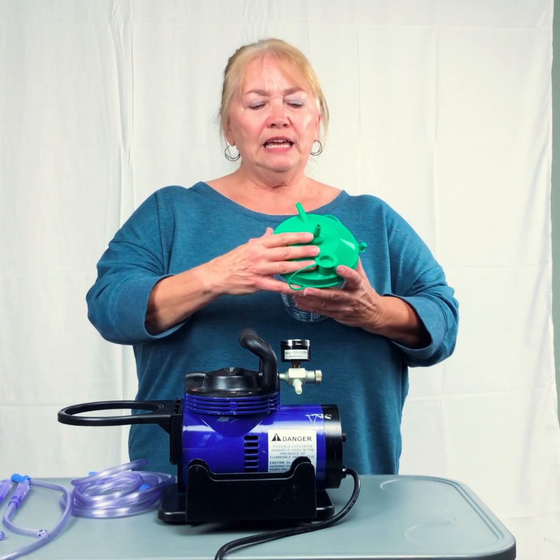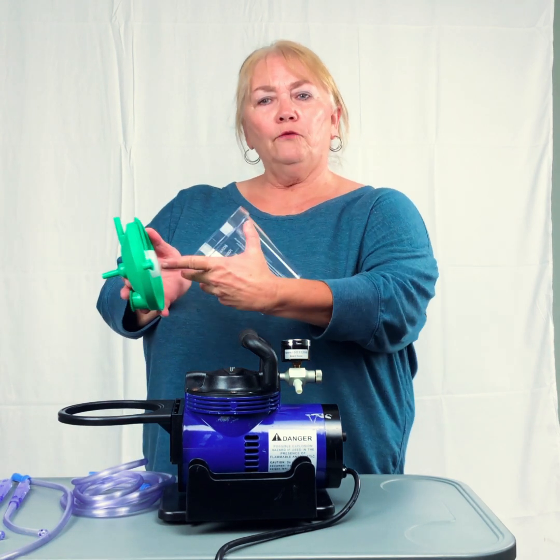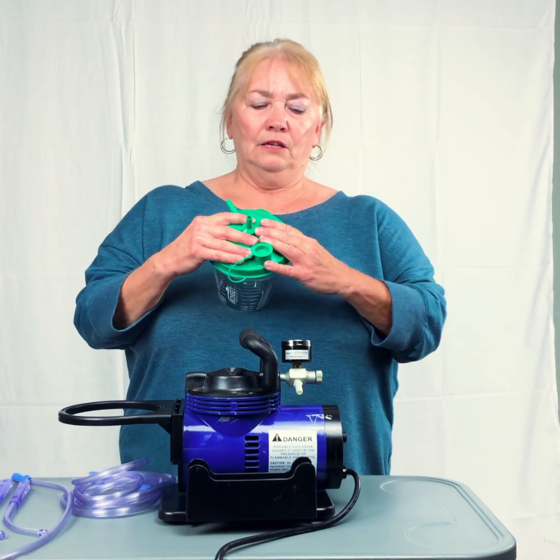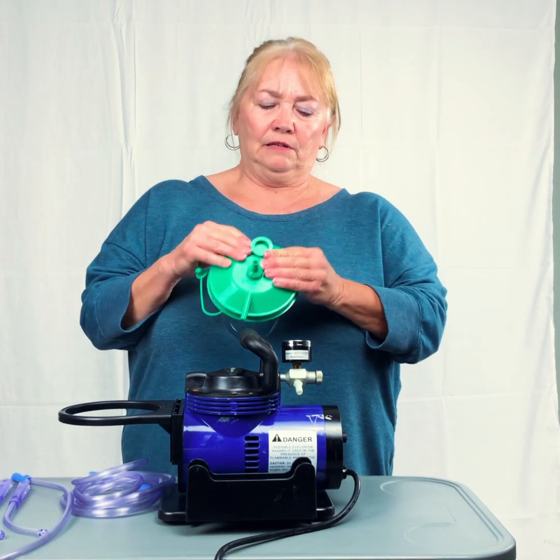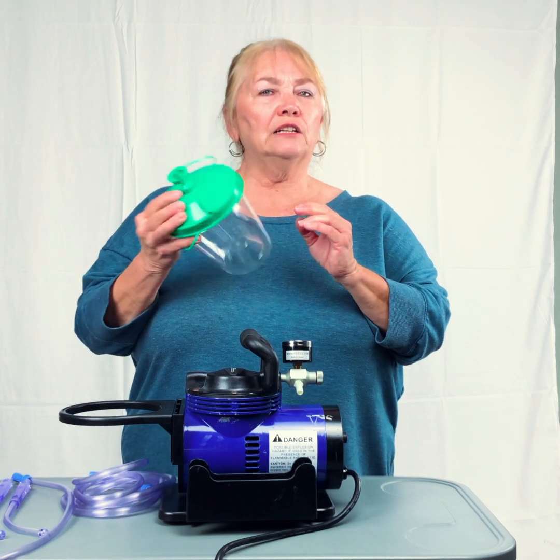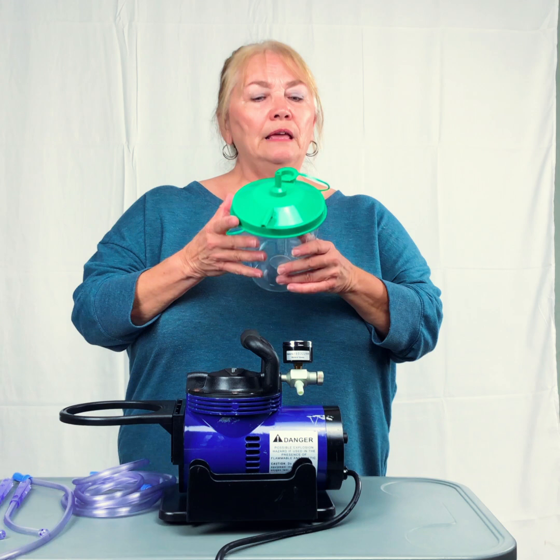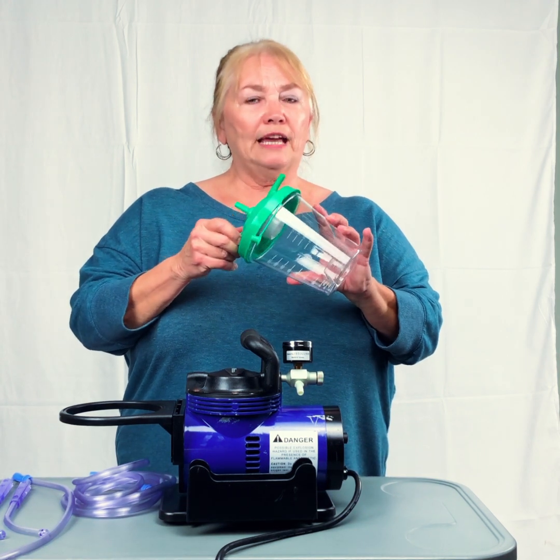Sometimes when you empty your canister, stuff will get up in here and cause it to stick. So as long as it's loose, and you can tell that if you shake it a little bit and you hear it rattle, then you know it's good if it's the plastic one. The other two you have to just look at.